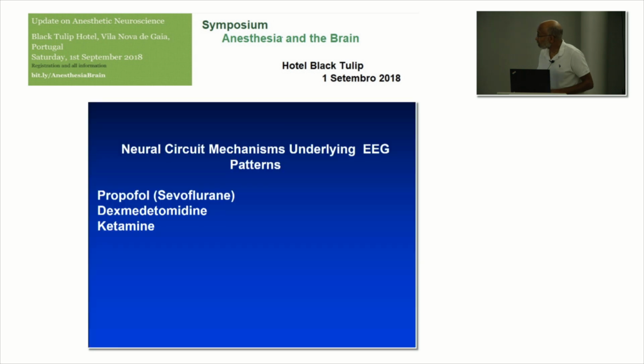So I just want to say a little bit more about neural circuits. I talked about the slow oscillations for these drugs, but I just want to talk a little bit more about some of their other effects. In particular, with propofol. As Tony was talking about earlier, there's all this discussion about whether or not you have frontal-parietal disconnection as one of the mechanisms for reducing consciousness under anesthesia.